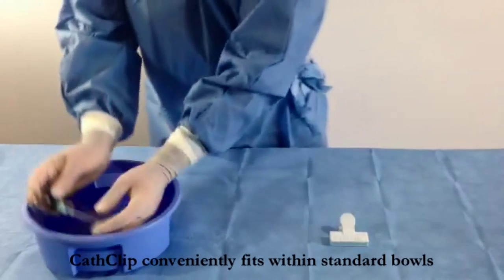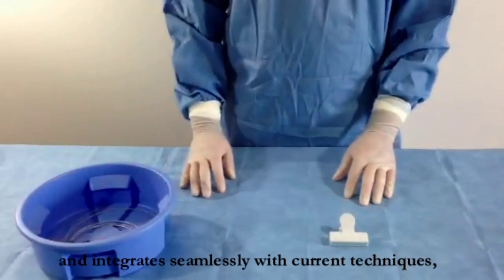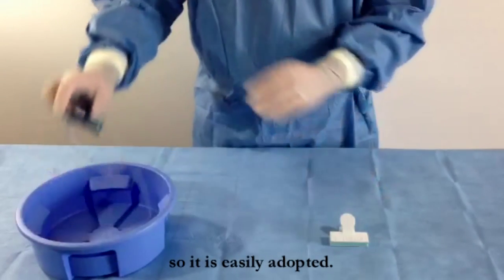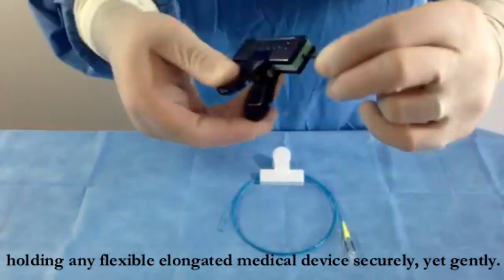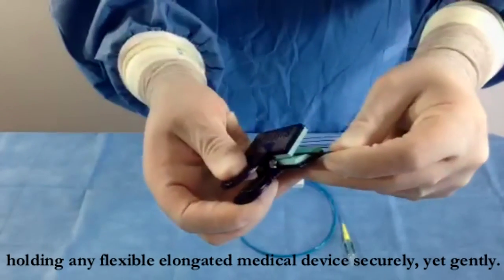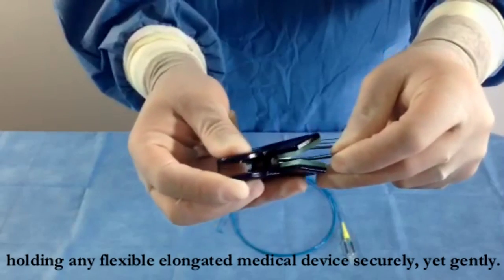CathClip conveniently fits within standard bowls and integrates seamlessly with current techniques, so it is easily adopted. CathClip's foam gripping pads are durable yet soft, holding any flexible elongated medical device securely yet gently.